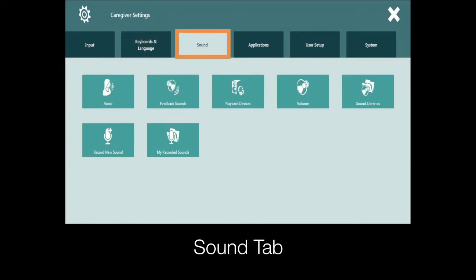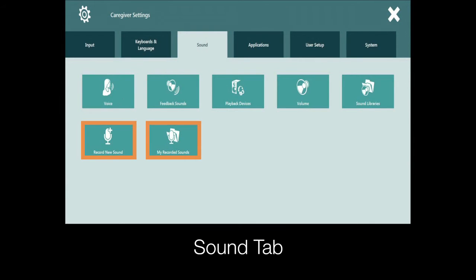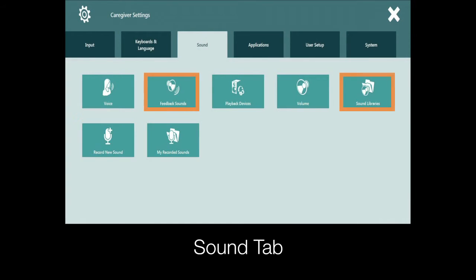The sound tab offers settings that you will need to manage the voice, volume, audio recordings, and sounds for your software.